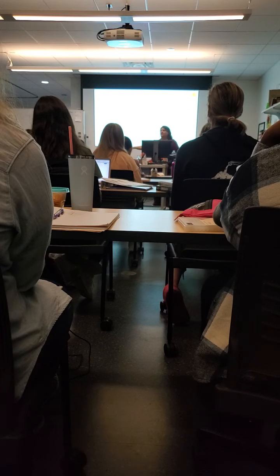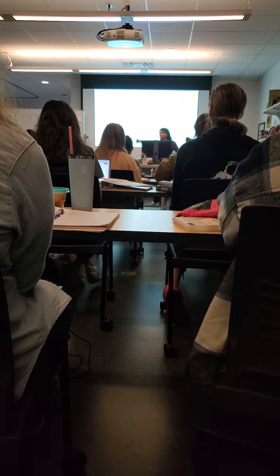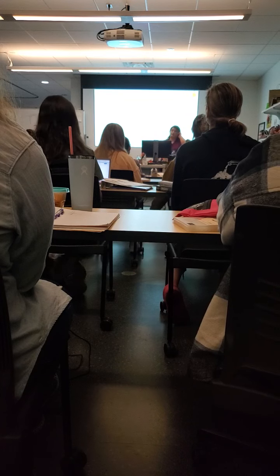So the reason why we need to know this measurement is because they could have portal hypertension. And this is where the normal flow is hepatopedal, and that's what it should be, versus, what's the other? Hepatofugal. We talked about this last week. Do you guys remember? Hepatopedal, you're like pedaling in, right? I always just think you're on a boat on water, paddling in. You're going in.